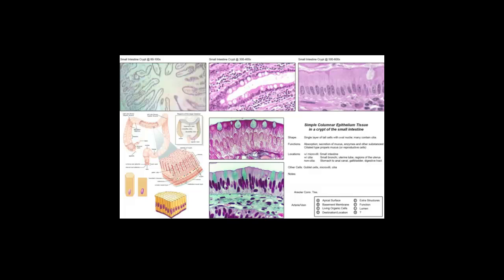actual villi. Each of the villi are seen up here at a low magnification, and on the villus itself, as you magnify that, you would find a dark line or a brush border seen here on that apical surface for increasing the absorptive surface area and the absorption of nutrients that are required from the food that's been eaten.